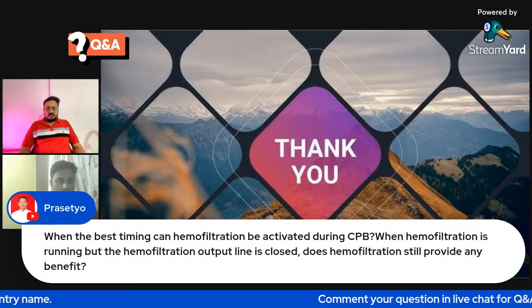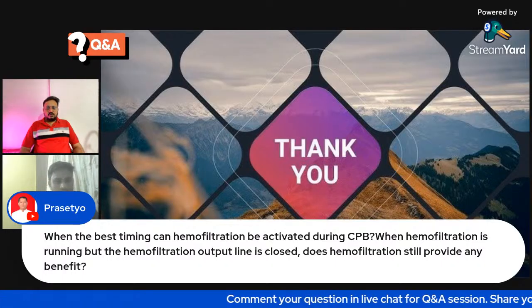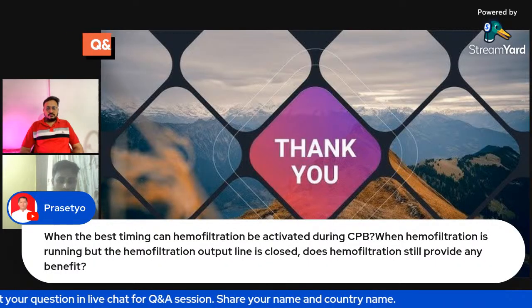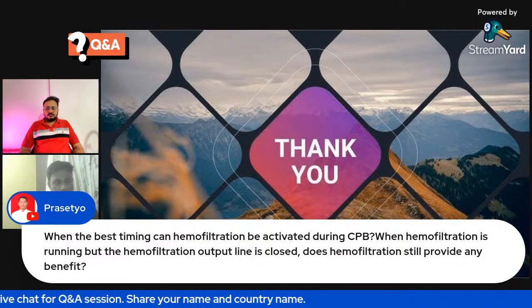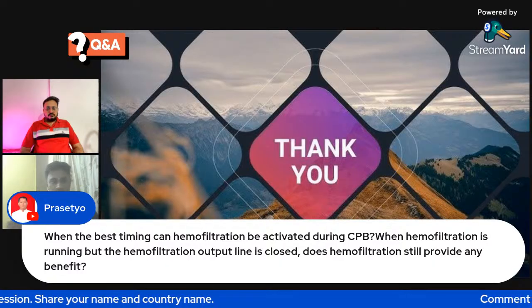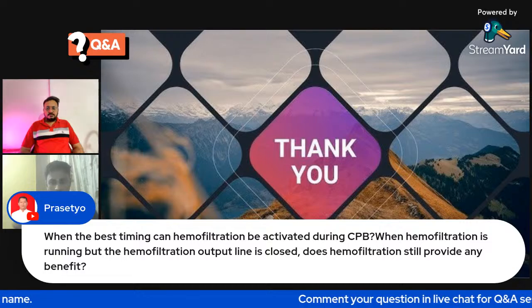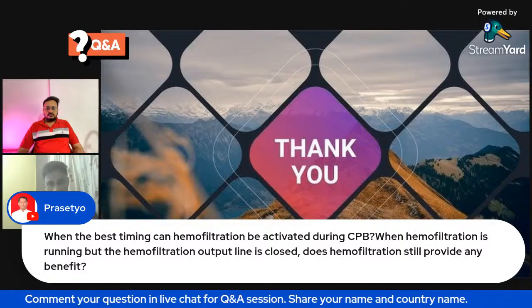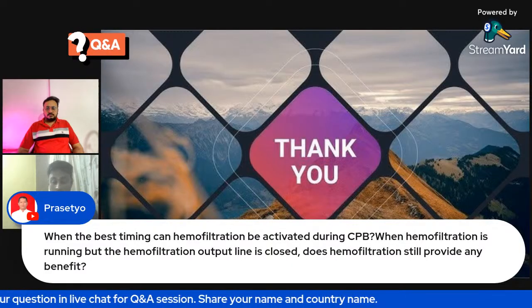I guess we can partially clamp the output line. No, sir. My suggestion is, according to transmembrane pressure, hemofiltration blood flow majorly depends upon blood inlet pressure plus blood outlet pressure, divided by two, plus vacuum pressure. Vacuum pressure is most important for filtration.